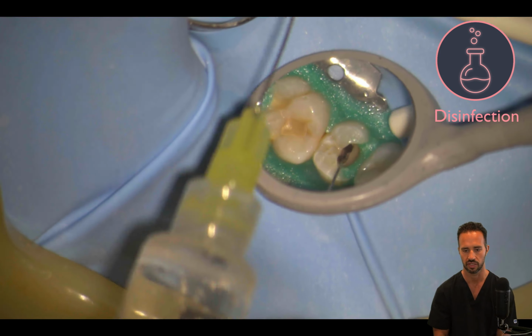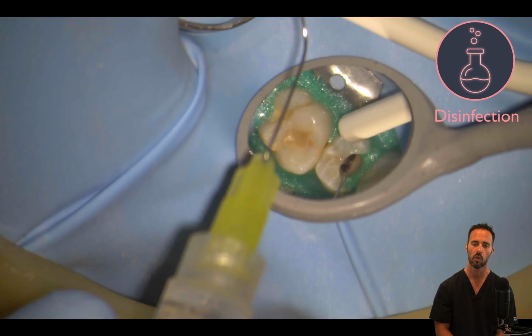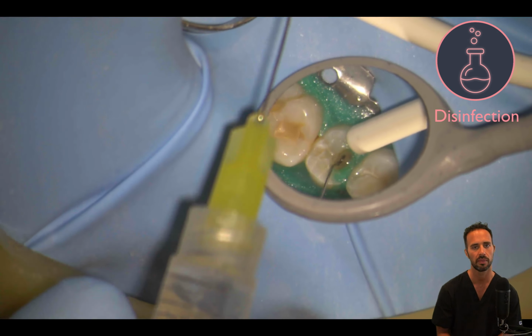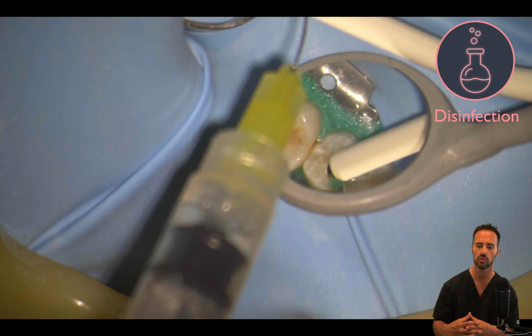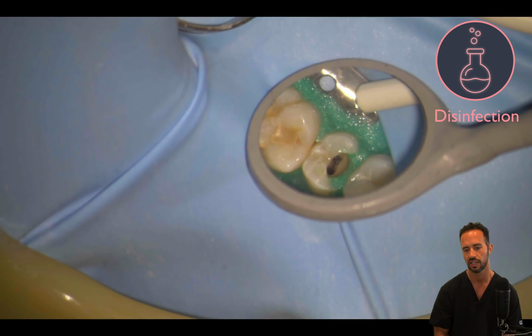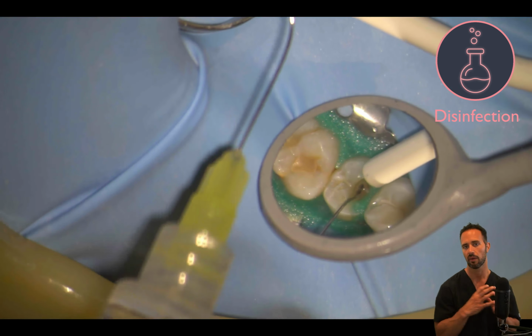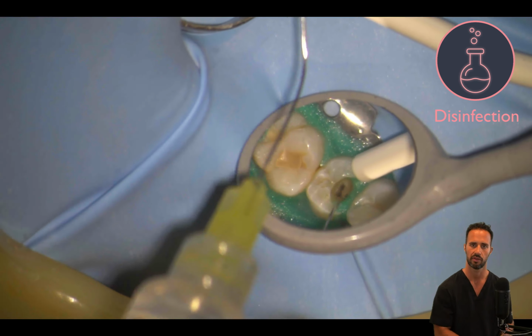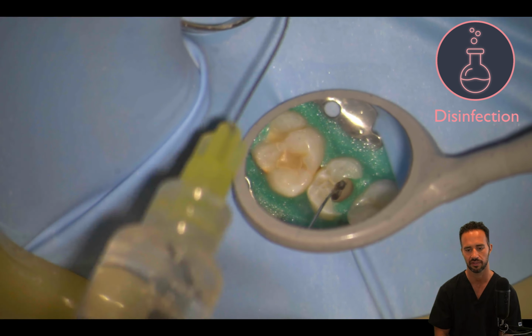That's what we're doing first in the palatal, and then in the buccal canal. And then we're gonna proceed with our 17% EDTA rinse, okay? So you only need 3 milliliters of this or so in the syringe. It's not as critical that you soak it for a full 60 seconds in a vital case like this, okay? So you just wanna make sure that you pass some EDTA through, and then back to our final rinse of half-strength sodium hypochlorite, okay? So remember, hypo, 17% EDTA, and then more hypo at the end.